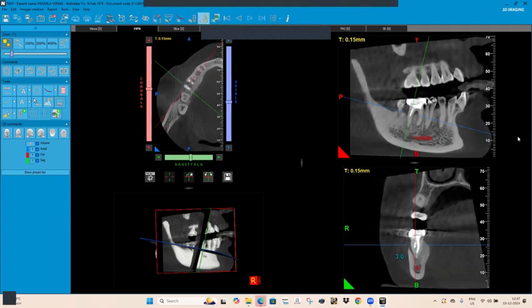That is true. All these things are very recent, where they are doing many things with the pulp chamber, like you said, measuring the volume and going into the details of everything, which is not possible with the present software the NNT is providing, I guess.